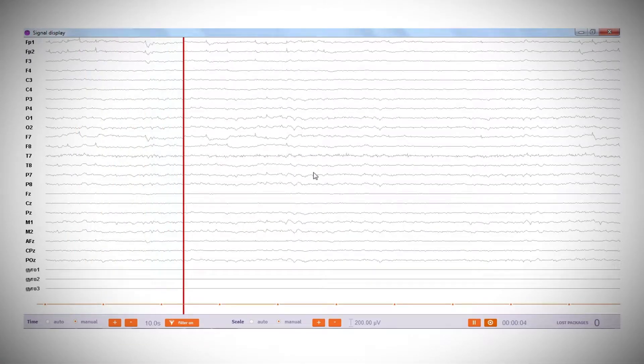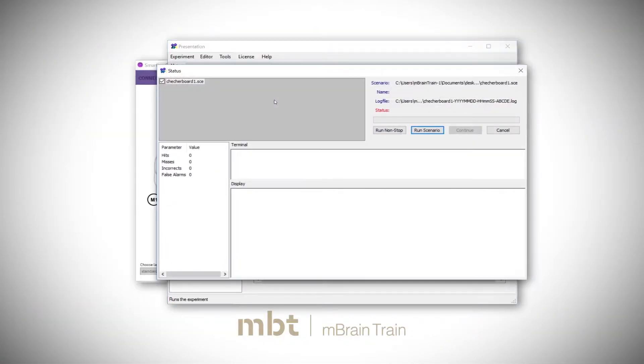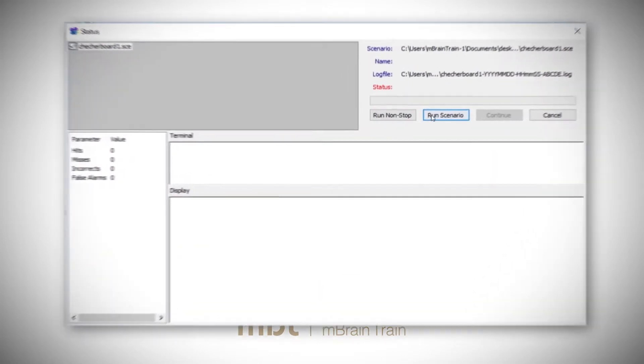Go back to the presentation window and click on Run, then the Run Scenario button to start the experiment.